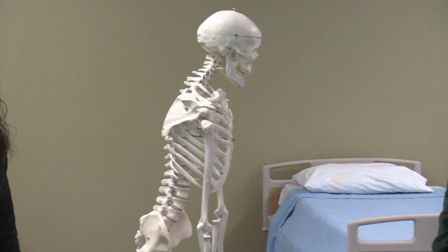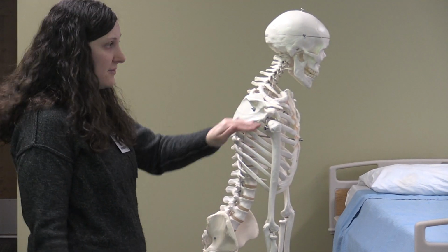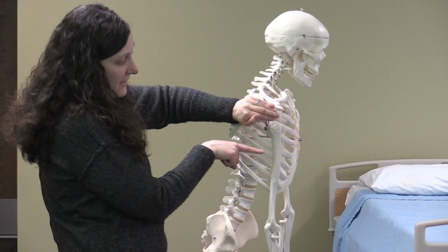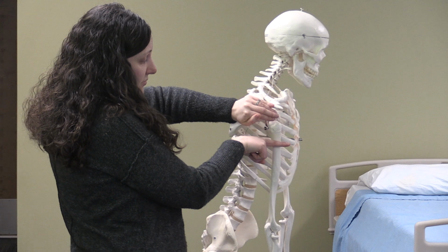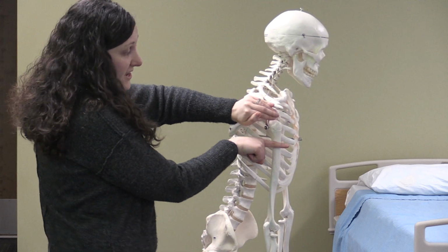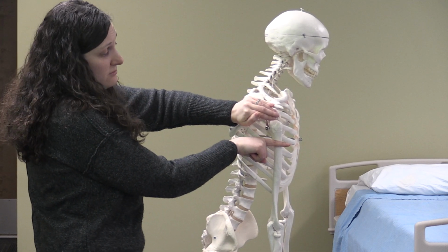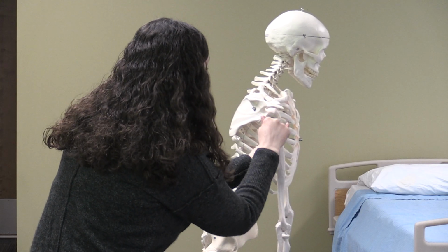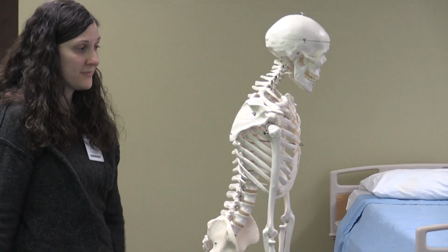So then, if we're moving over to Mr. Bones this time, putting our pinky on the acromion process, drawing that imaginary line from your patient's axilla, at the base of your line, you're going to put the V and you're going to inject between for that one.